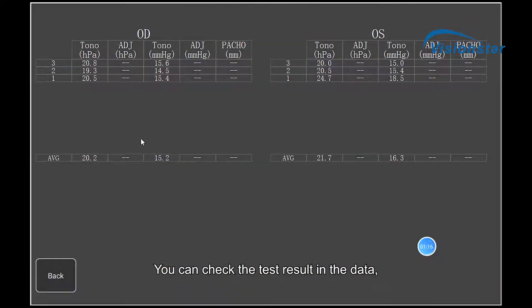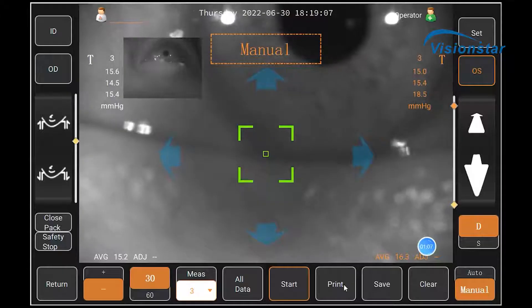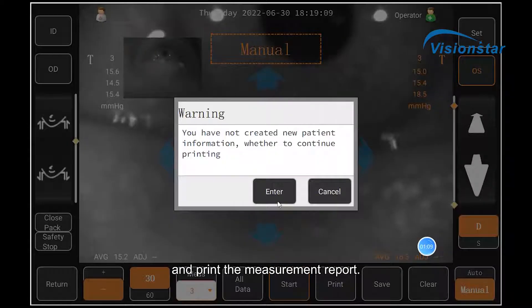You can check the test result in the data and print the measurement report.